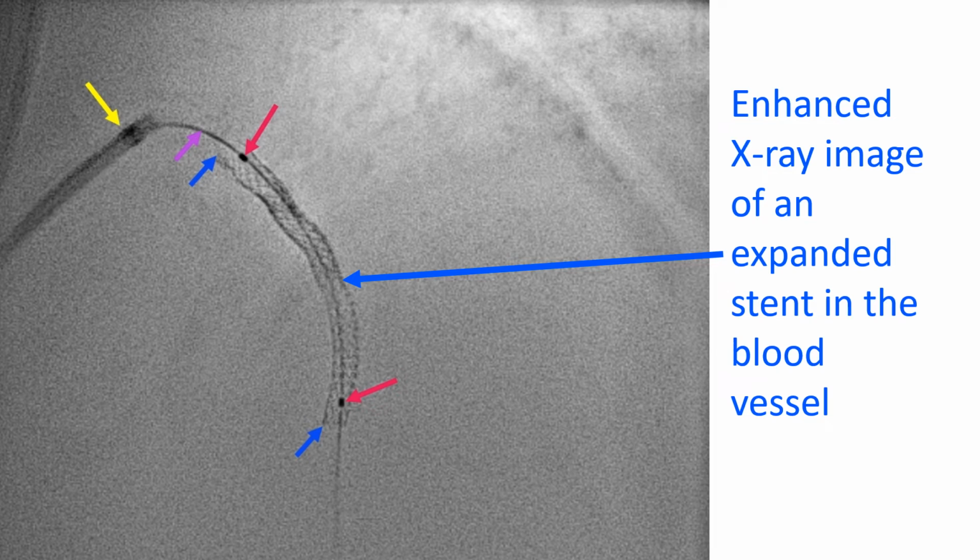Stents are tiny metallic structures like springs meant to hold the enlarged vessel lumen in position without closing off. The cost of stent depends on the type of material used, stainless steel stents being cheaper than cobalt chromium stents. Drug-eluting stents have a polymer coating holding drugs which prevent narrowing of vessels treated by angioplasty.